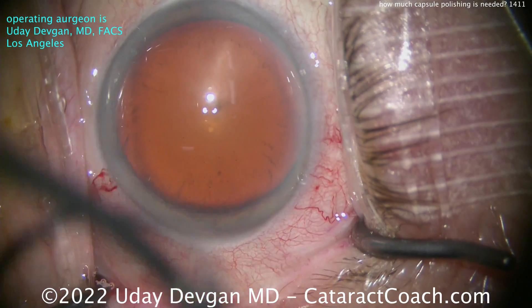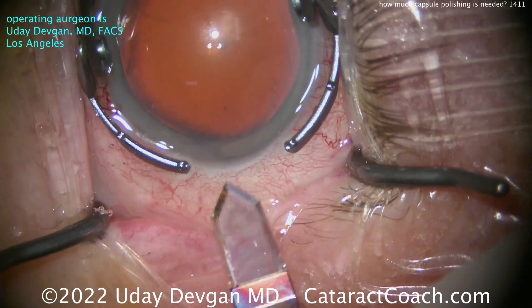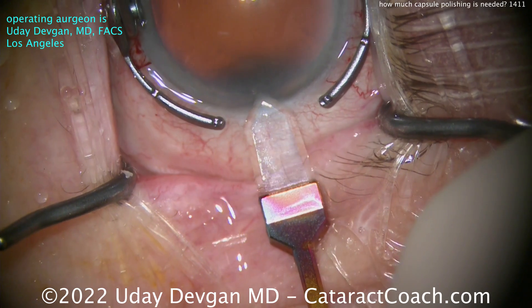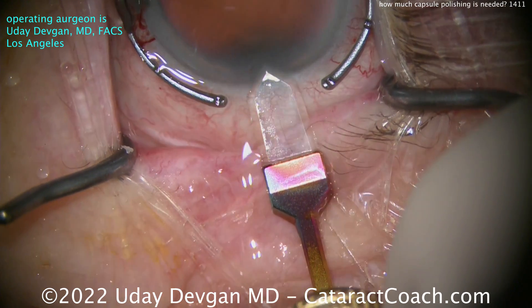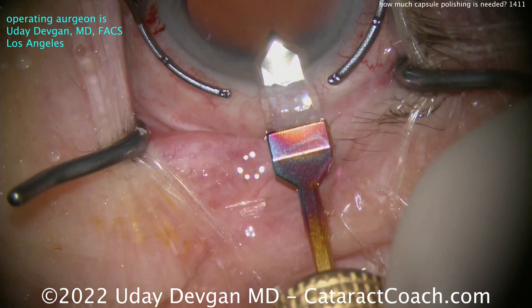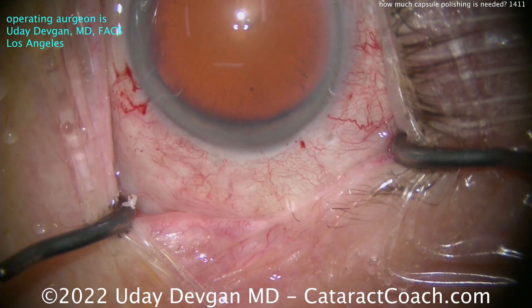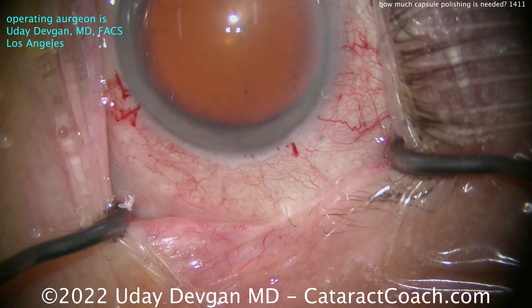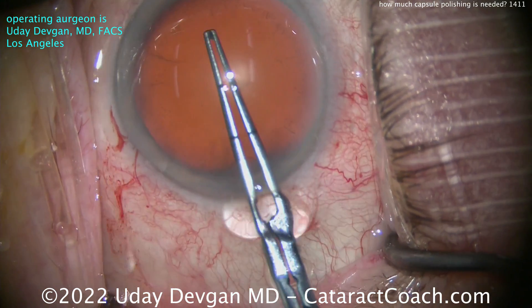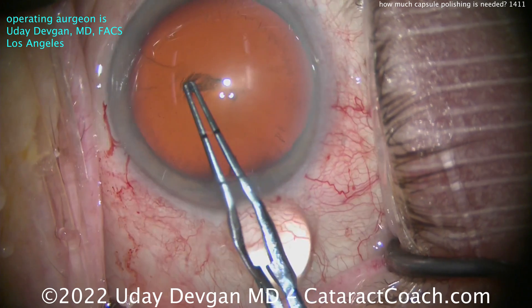This patient is 94 years old — a pretty healthy 94-year-old. Everything is pretty nice in her life and now it's time to fix the vision and enjoy nice sharp vision. But my question to you is: is surgery different for a 94-year-old? Well, we know it is. We've made videos here that cataract surgery in nonagenarians, or those over age 90, is different for sure. Look at the wrinkling of the capsule.